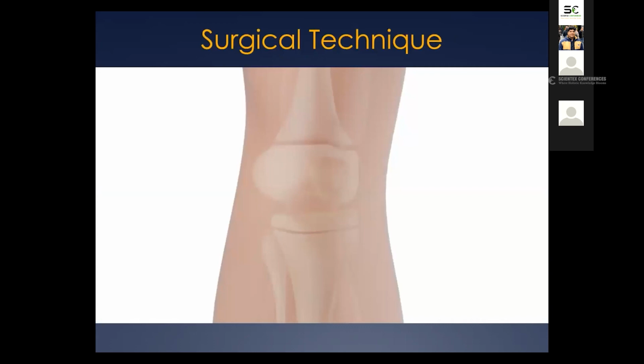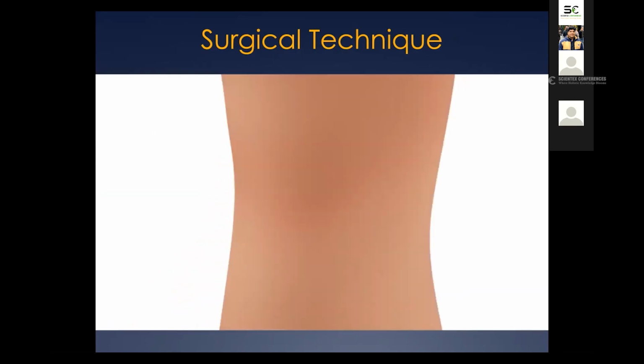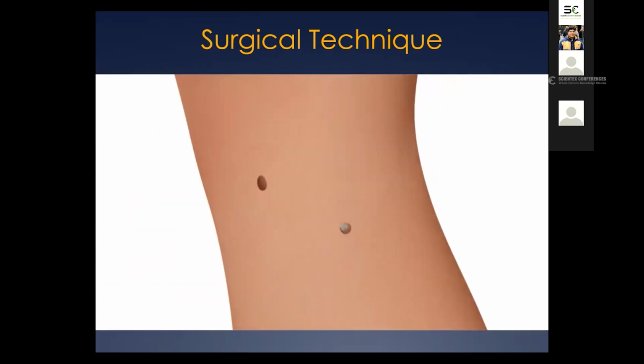This is the surgical technique. We start the surgery using 2 millimeters diameter wire, set 1 centimeter proximal and the other 1 centimeter distal to the physis, both wires parallel between each other and to the physis. After that, 4 small incisions were made at the points where each wire exited the skin.